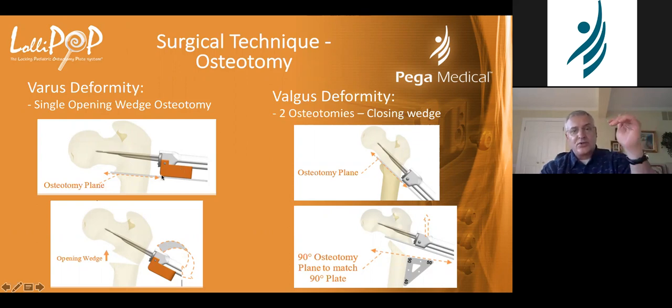So this tells you this is the closest you want to be to the blade plate. If you go any closer, you're going to run into your offset, and you're going to have to chisel away. And I'll show you some examples of that when I did it early on.